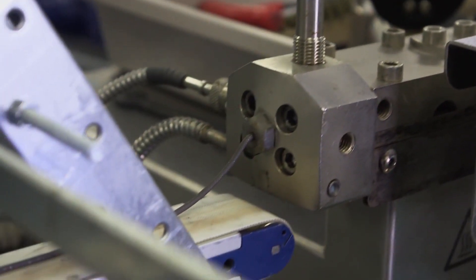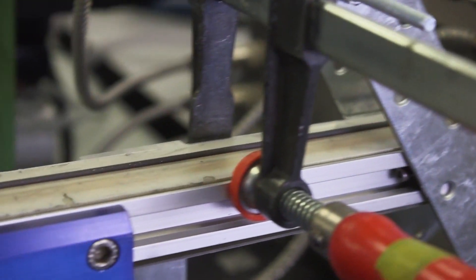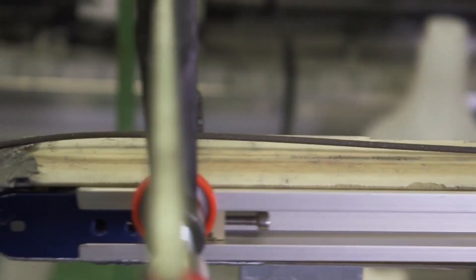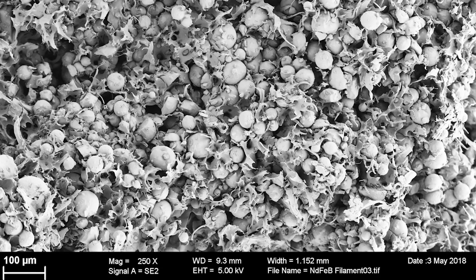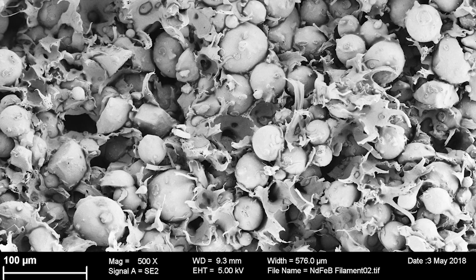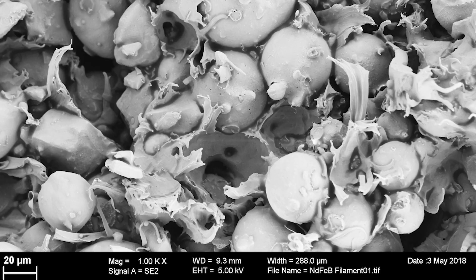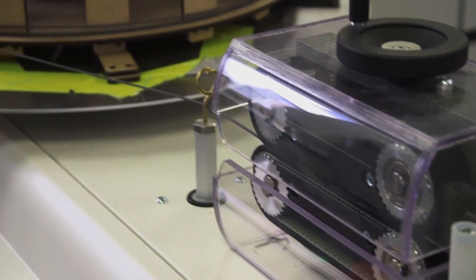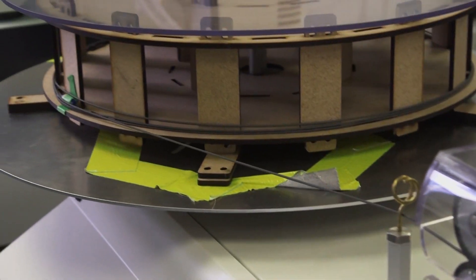We iterated with many polymers and compositions, tested for printability, mechanical and magnetic properties, and started over again. Our final composition has a loading of 92 weight percent, which corresponds to a very dense packing of the magnetic spheres and the polymer in between. We reach remanences of 350 milliteslas, which is well within the range of what you would get for injection-molded magnets and roughly 25% of the strongest sintered neodymium iron boron magnets.